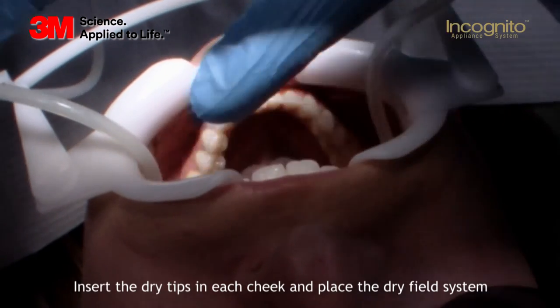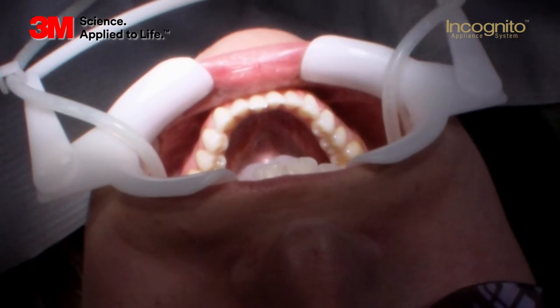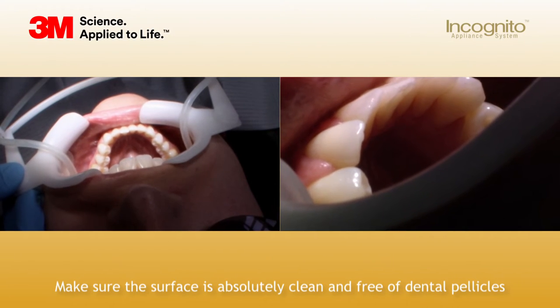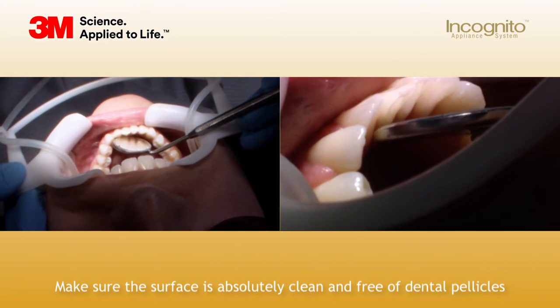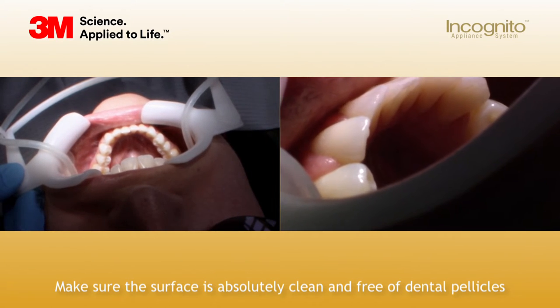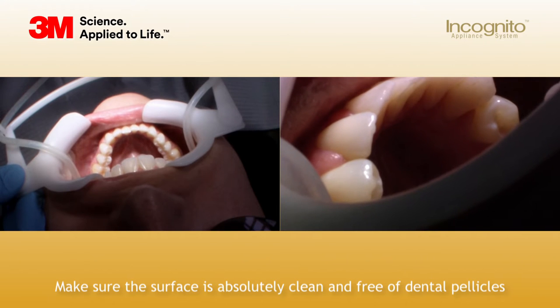Now we have clear visibility of the area where we want to bond the brackets — the lower arch. Before you bond every case, you have to make sure that the patient sees a hygienist at least one week before the bonding appointment. It's really important to check the lingual surfaces to make sure they are clean. I make sure that they see a hygienist at least one week before our bond-up. This gives me the opportunity to have a really nice bonding procedure with no rebonds. Always make sure the tooth surfaces are really clean.